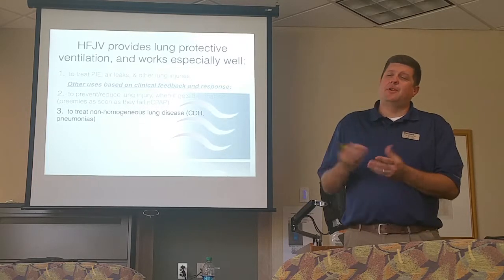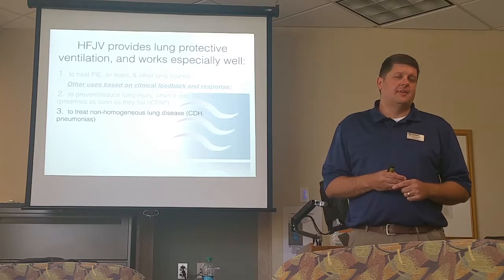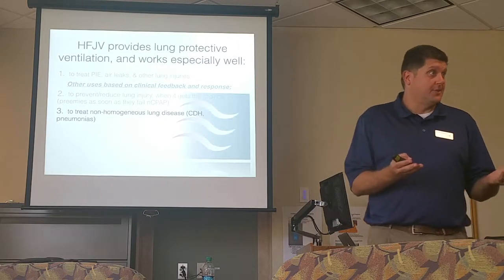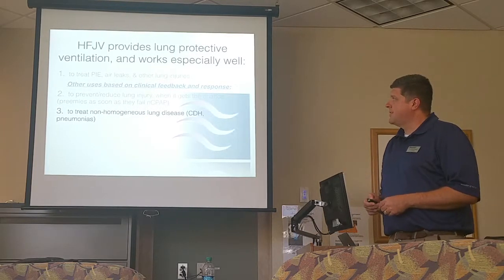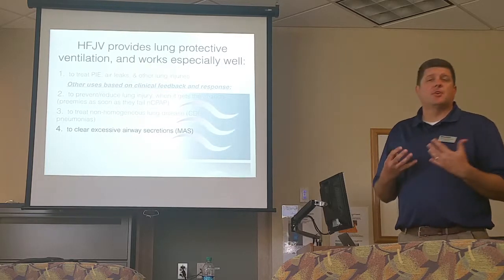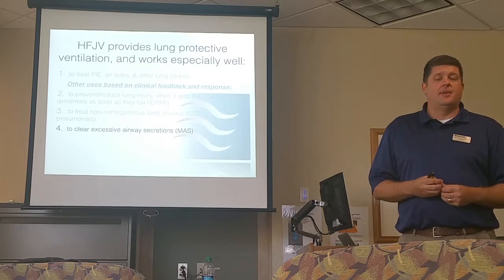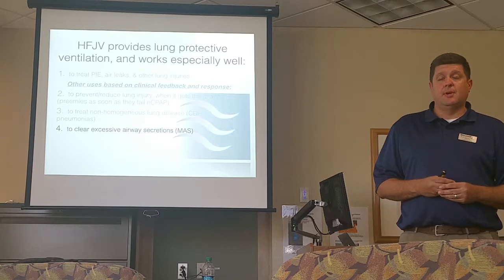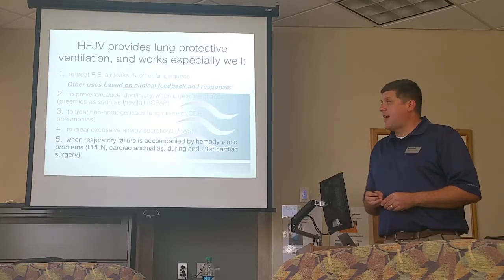That 1 to 2 I:E ratio with the oscillator and the higher application of mean airway pressures would certainly suit those patients a little better. But non-homogeneous disease processes have responded very well to the jet. Meconium aspiration, secretion, pneumonia type processes where you have lots of secretions. The long exhalation times can work very, very well to removing the secretions.